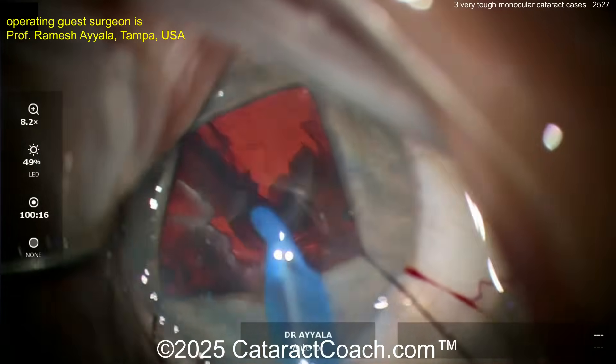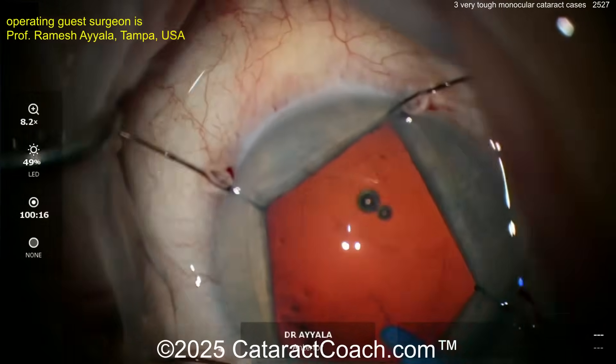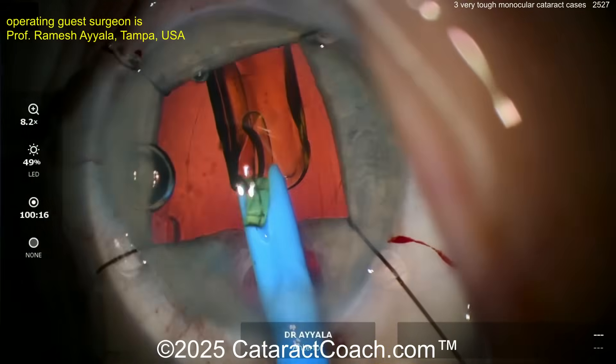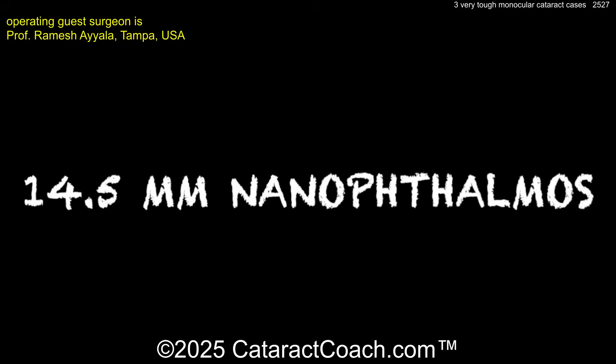Nucleus is coming out. There's a little sub-incisional iris damage there, which is okay — we're going to live with that. Now taking out the cortex with coaxial cortex removal. There's the rhexis. Clean out the bag as much as we can. Here comes the lens — a single-piece acrylic going into the capsular bag. Looks like a non-toric monofocal lens, which is great. And at the end, all done. Let's go to the next eye.